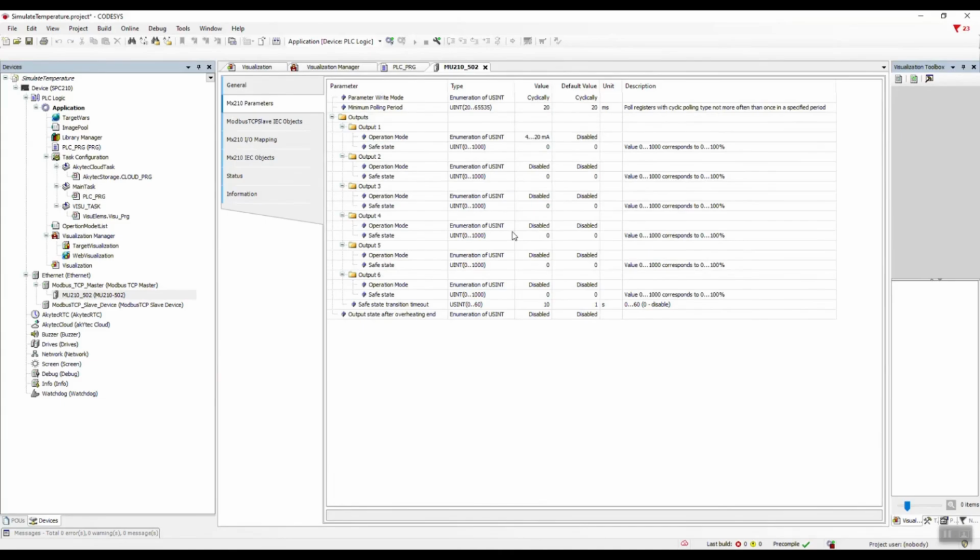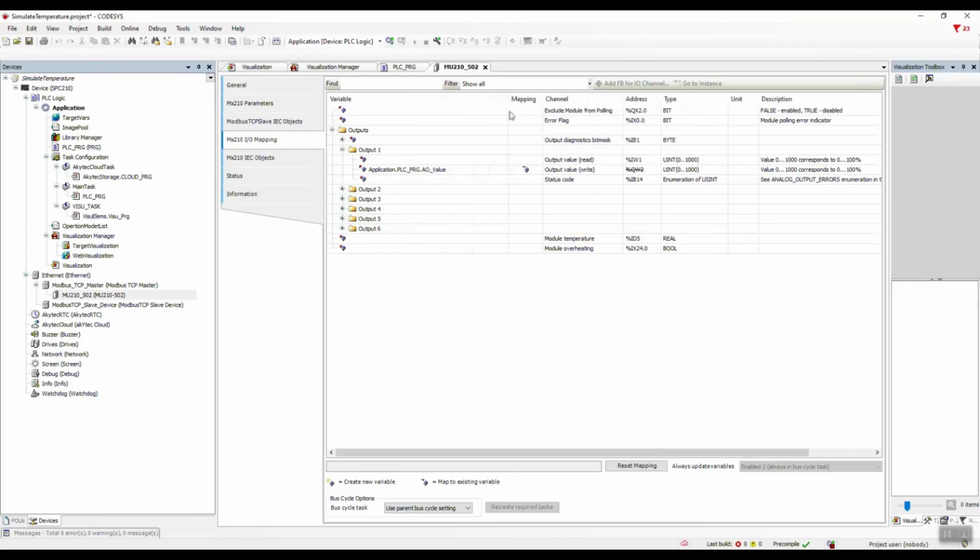In the Parameters tab, let's set the operating mode for the first analog output to the range from 4 to 20 milliamps. Write in the comments whether we need to configure a safe state for the analog output in case the MU210-502 module loses connection with the SPC210 controller. Now, navigating over to the Input-Output Mapping tab, we are going to establish a link between the analog output control signal variable and the specific channel, output value right.